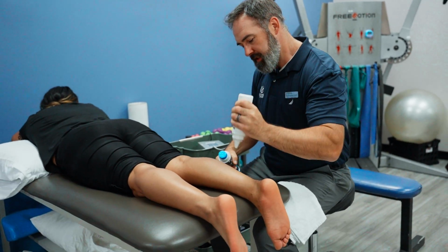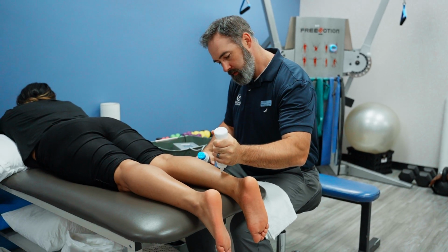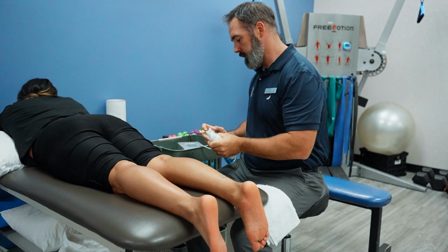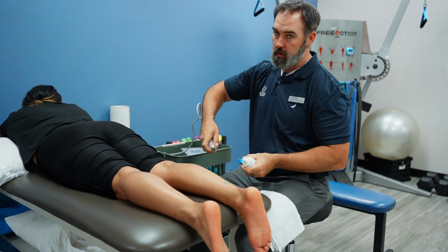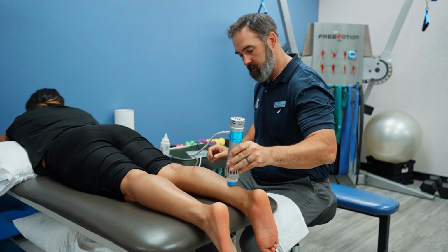So I'm gonna apply a little bit of ultrasound gel to the area. You can do it without the ultrasound gel. However, the head has a little edge to it, and I don't want it to scrape up your skin. All right, ready?